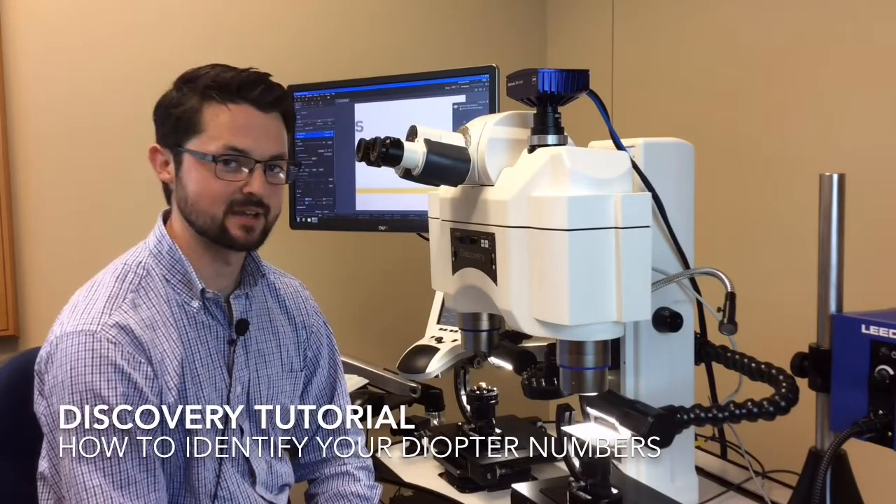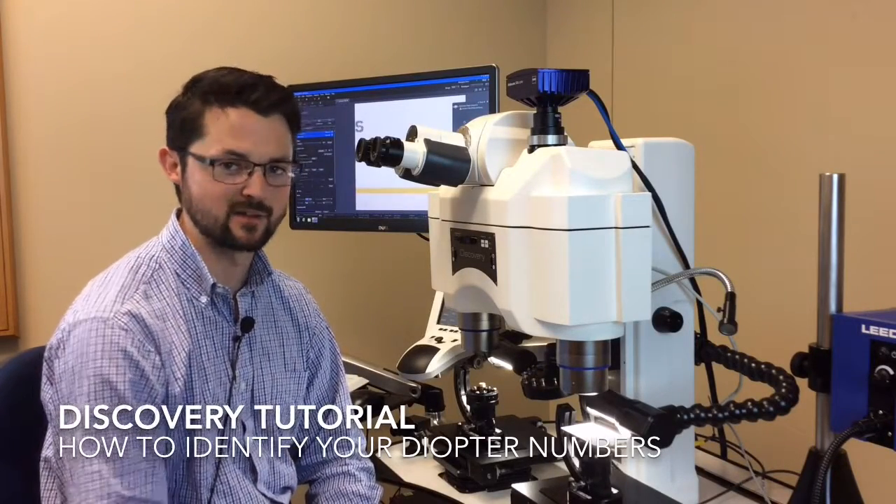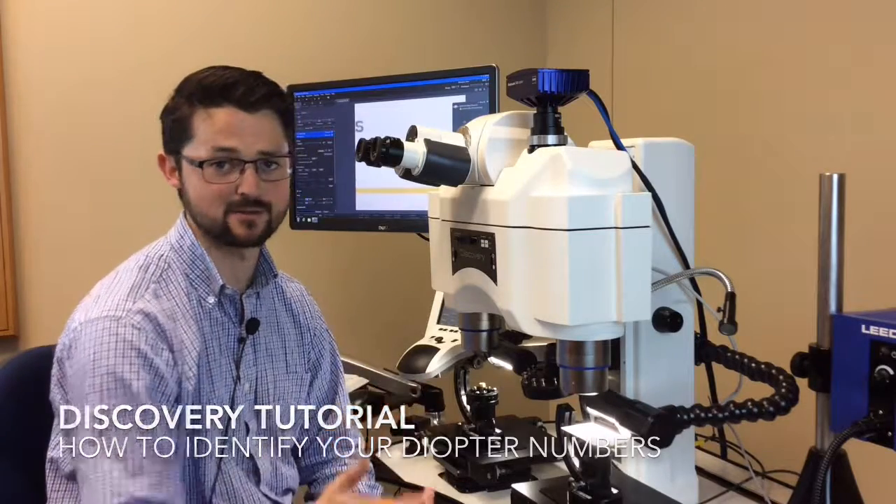Hello, my name is Jake Kurth. Today we're putting together a quick video tutorial on how to find your diopter numbers on your Discovery Series microscopes.